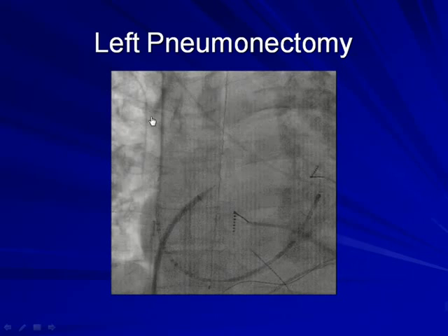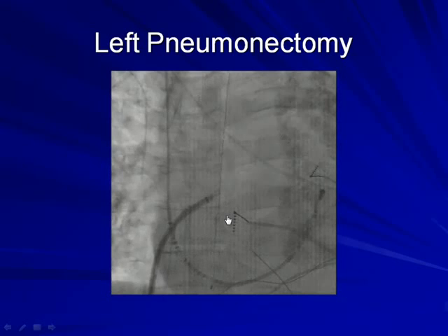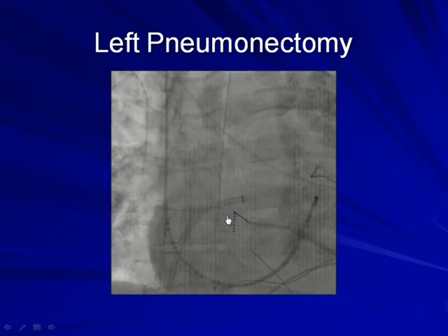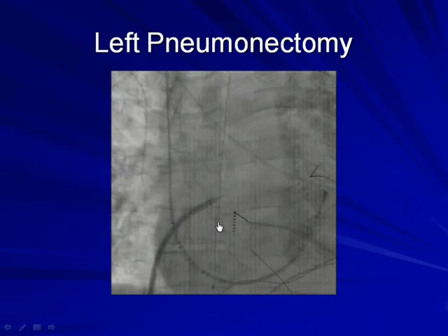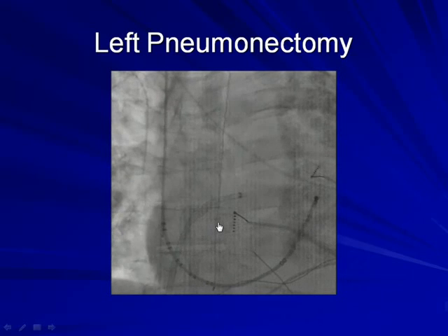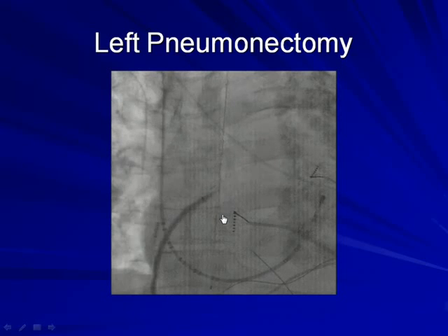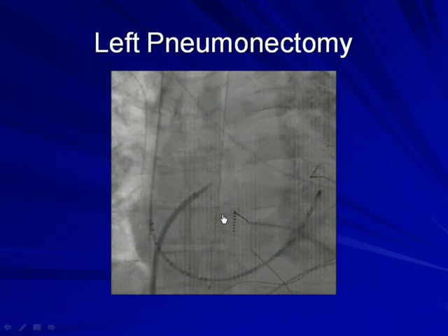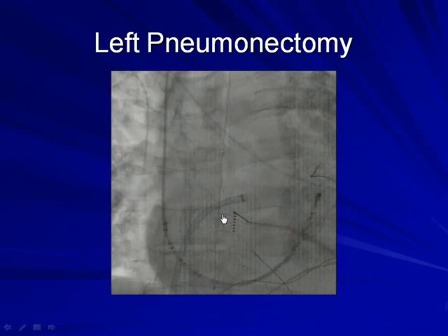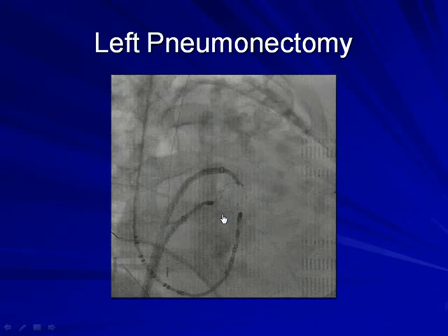This is a movie. This is just going across, and this is just a thoracic image, and it actually violates the point I'm trying to make, and that is you really can't just use fluoro in these cases. If that axis shifts considerably, the fluoro cues that you're looking for to help guide you in going across may not apply. You really need intracardiac echo or something to be absolutely sure you're in the fossa with this case. In this particular patient, as I told you, the left lung was missing. It's a little bit weird to see the left chest not moving at all with the heart, and obviously no diaphragmatic movement, but other than that, this is fairly normal.